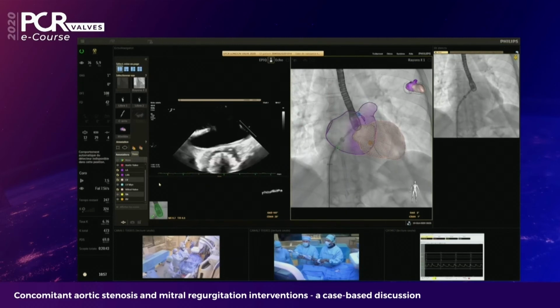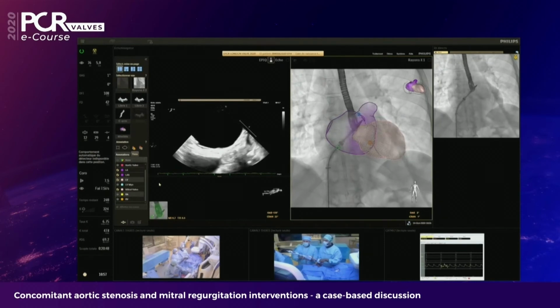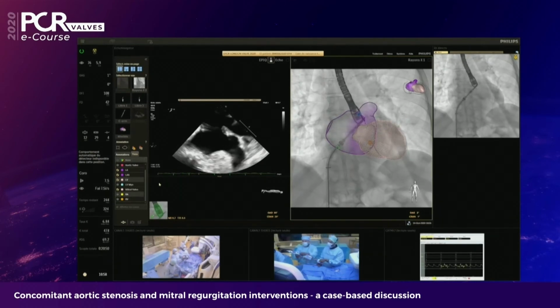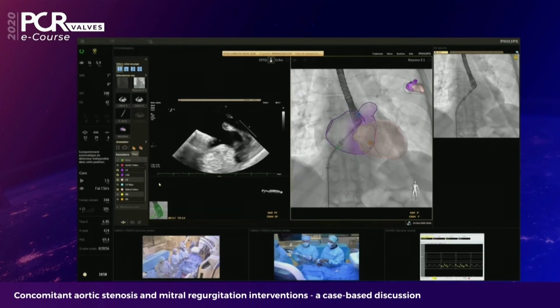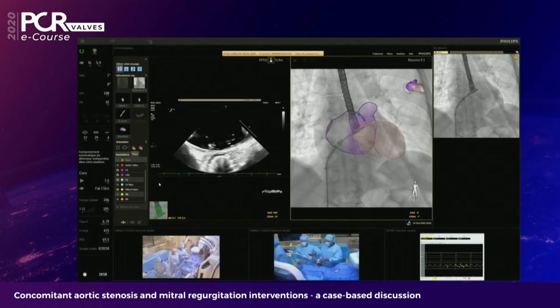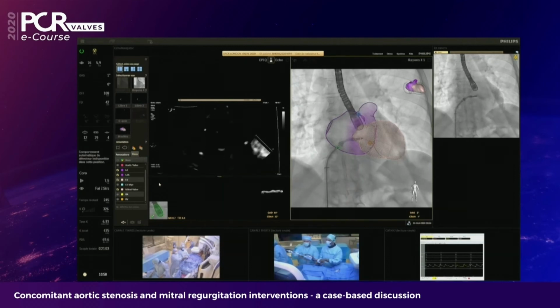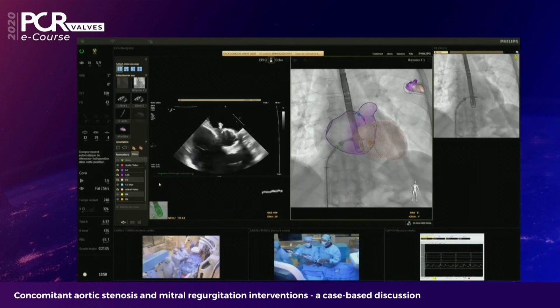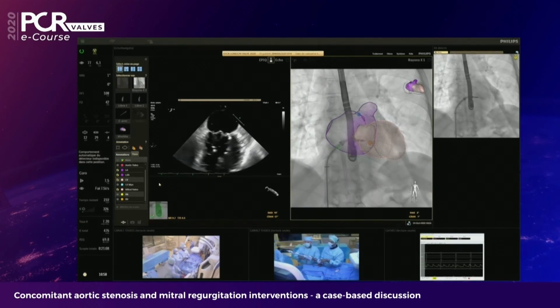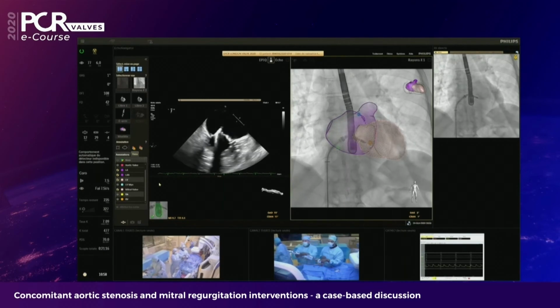Okay, so we pull. The more you advance in the left atrium, you try to pull a bit to give a better trajectory to your clip catheter. And Lionel is adding more medial now, you can see it, to approach the leaflets themselves. So we are in the left atrium, we are away from the ridge, and we are getting closer to the valve, as you can see it here.